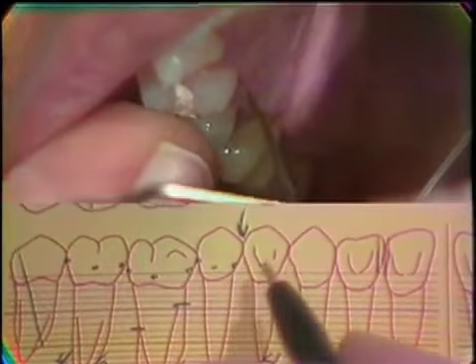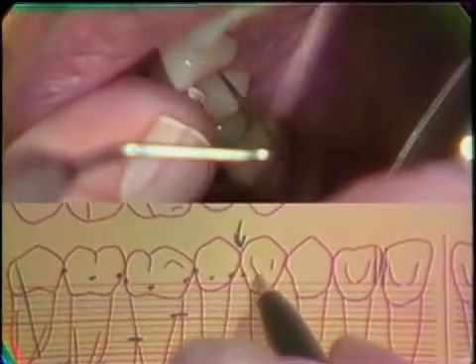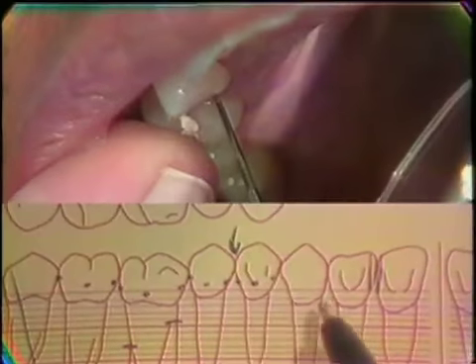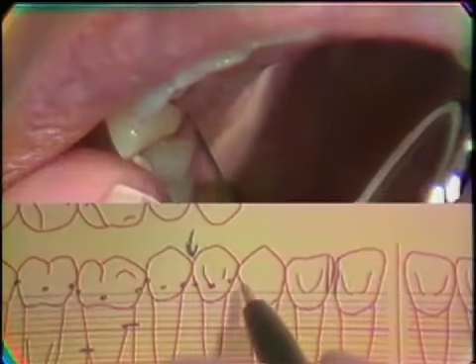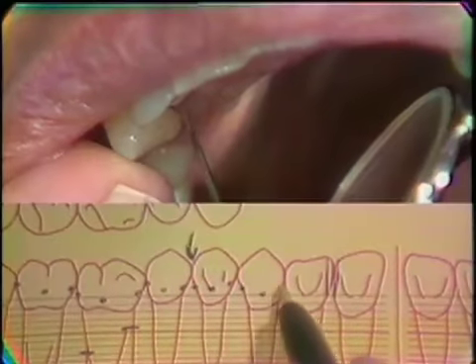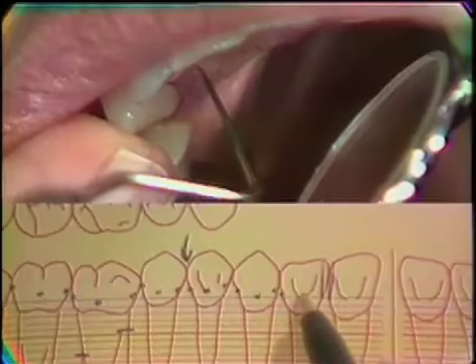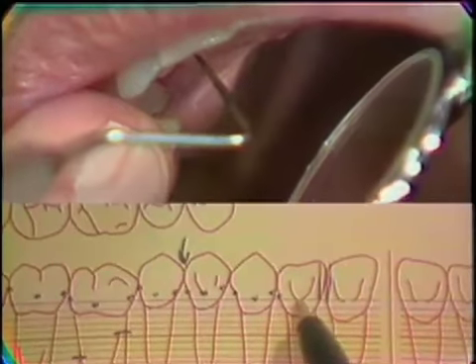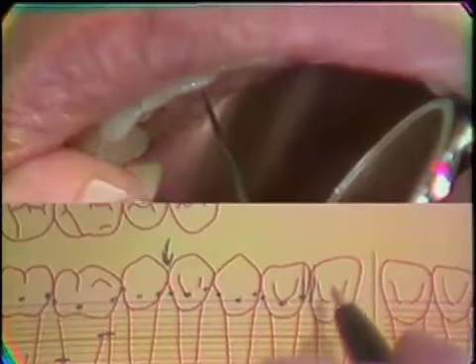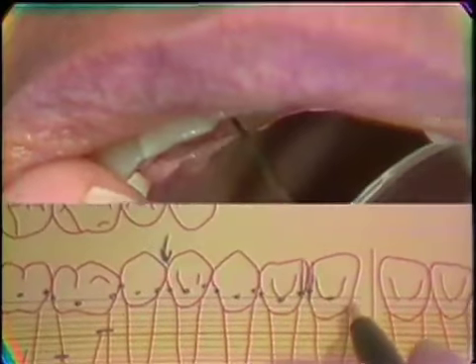Number 5. 2, 2, 3. Number 6. 3, 2, 3. Number 7. 3, 2, 3. Number 8. 2, 2, 2.